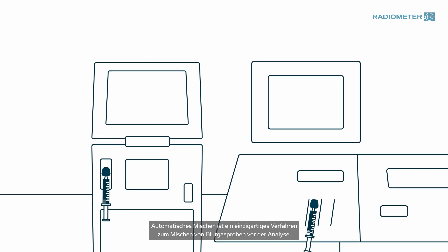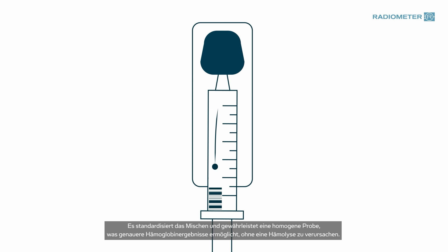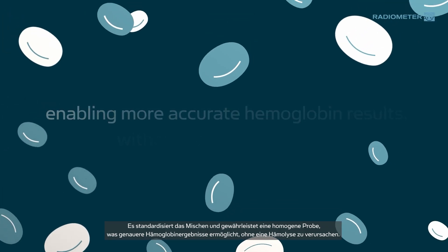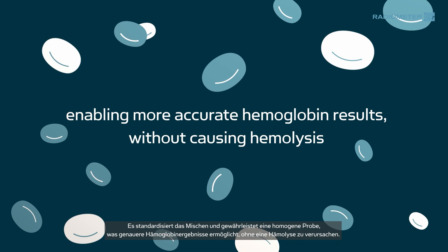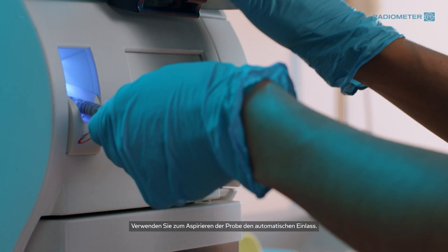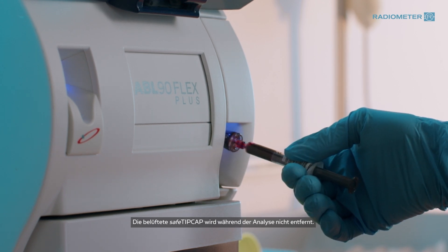Place the sample in the inbuilt SafePico mixer for automatic mixing. Automatic mixing is a unique way of mixing blood gas samples prior to analysis. It standardizes mixing and ensures a homogenous sample, enabling more accurate hemoglobin results without causing hemolysis. Then use the auto inlet to aspirate the syringe. The Vented Safe Tip Cap stays on while the blood gas sample is analyzed.